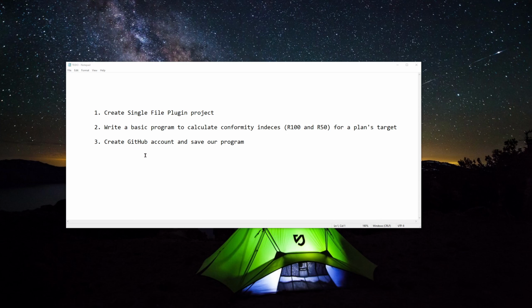We also added some checks and that sort of thing. So if you want to go back and watch that just to see some of the things that we did, or to follow along live, then you can do that.